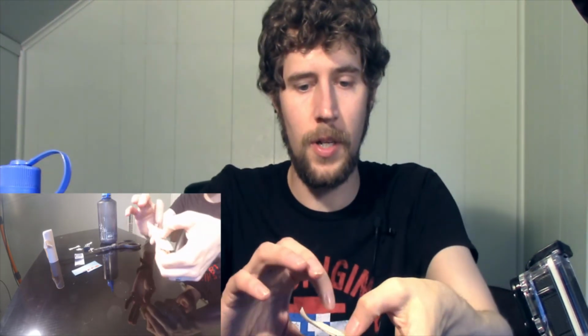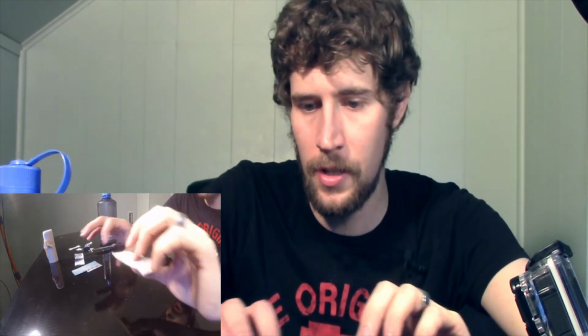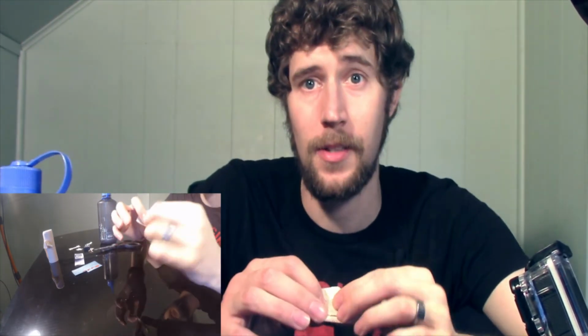These things are expensive. If you had to use these every night or every day, you'd have to take out a payday loan or sell one of your kidneys or something. So that's why I do this. It's a lot cheaper. You can pick one of these up for like $5, online or at your local Rite Aid. That wasn't product placement, don't worry. So basically, this is all a nasal strip is: a springy thing in the middle and some sort of bandage, a sticky adhesive piece of material. And that's it. So I just stick it over my nose.